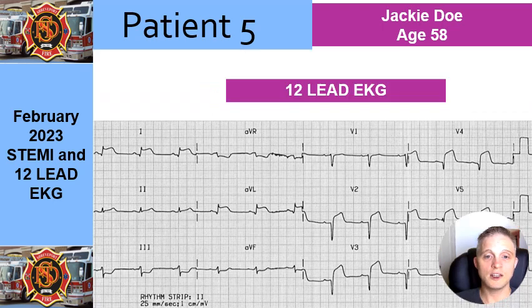We get the 12 lead, and now we see 1, AVL, V5, V6, V2, V3, V4. So again, what does this mean? Well, is this a lateral or anterolateral? Well, it looks like it's both. And we also have ST depressions as well. So it's not unusual to see the anterolateral coming, because as we remember from that blood flow, if it's proximal enough, meaning that it's coming directly from the feeder source from the heart into the heart's own vessels, it can include both. It just depends.